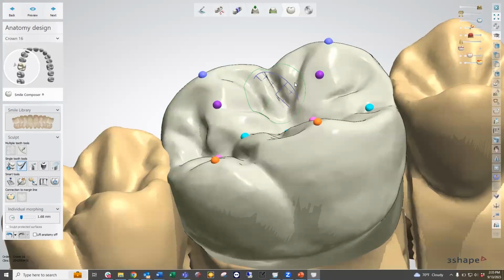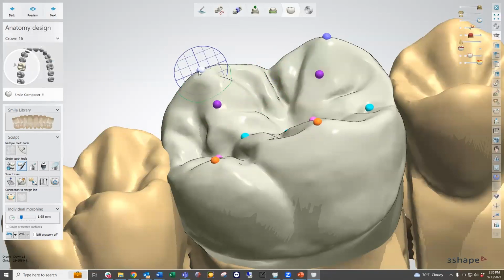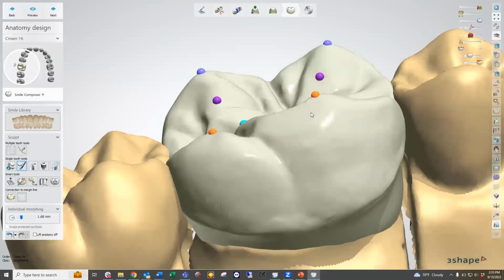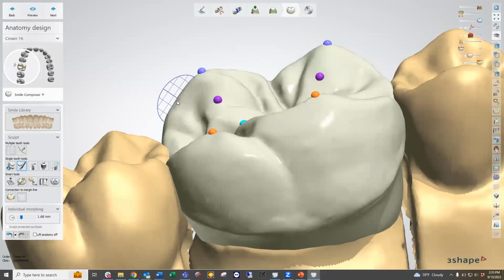Now, if I also hover over a dot, you can see that there are dots of the same colors or light colors. If I hit shift, it allows me to control both those dots, or all the dots that are the same color, at the same time. So I can do a symmetric design. So if I wanted to just drag this up, I can drag this up to make pronounced cusp ridges there. And then I can make slight changes over here to mimic what we have.